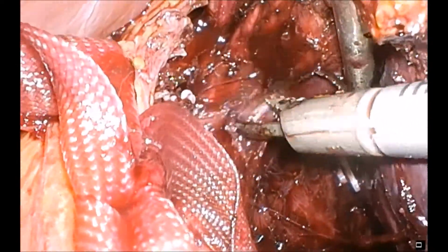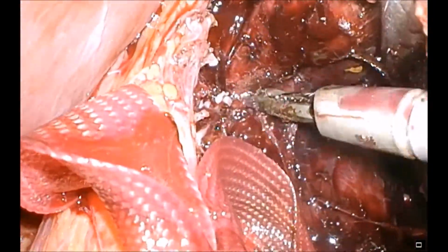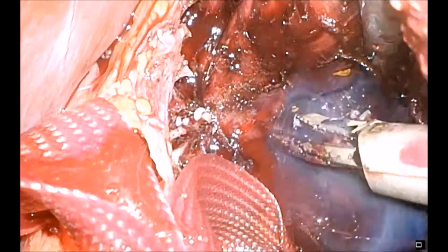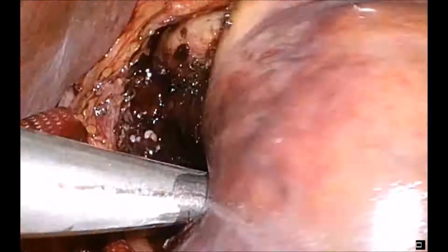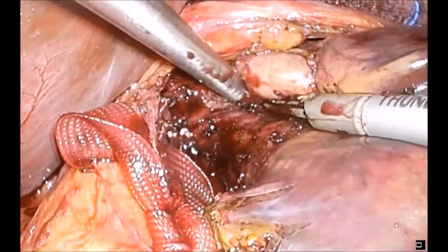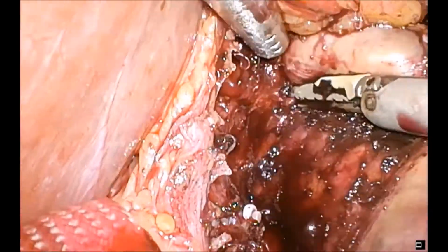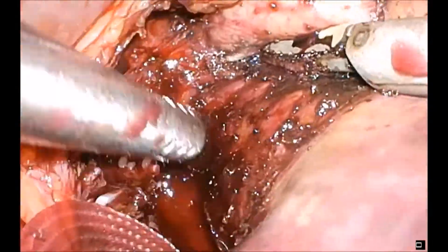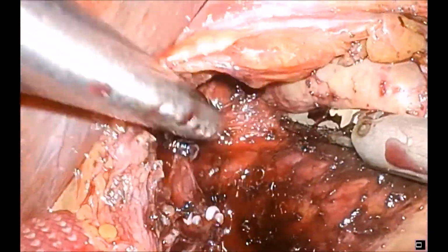With that bridge taken, it's now possible to elevate the caudate in a different angle to approach its last attachments, where it's thinning out in front of the inferior vena cava. A few small vessels remain attached between the porta hepatis and the caudate lobe.